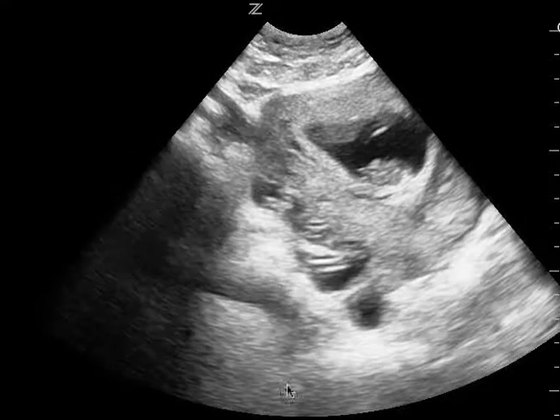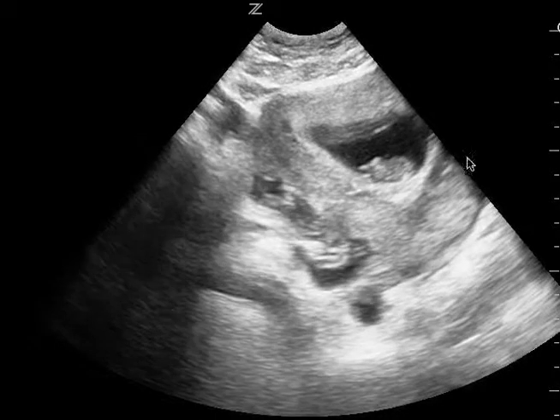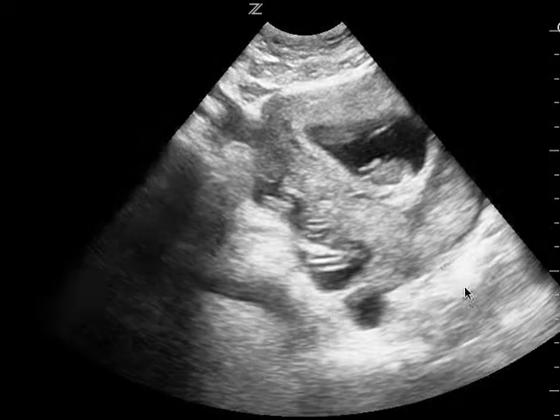First, it's a little over-gained. See how bright this is? It's a little difficult to see posterior to the uterus, and so you do want to turn the gain down a little bit.